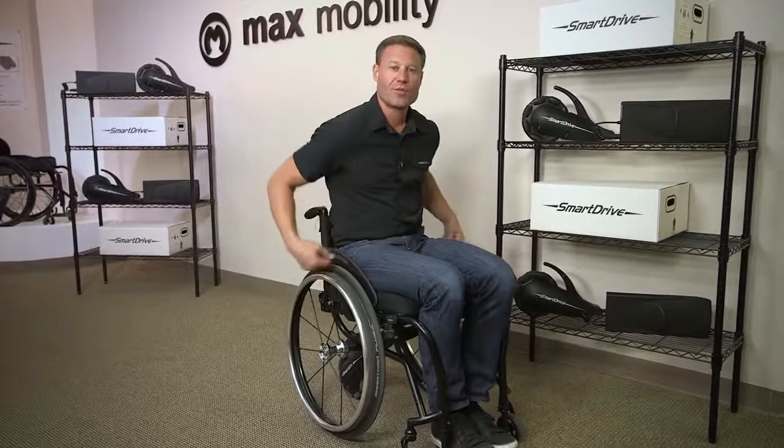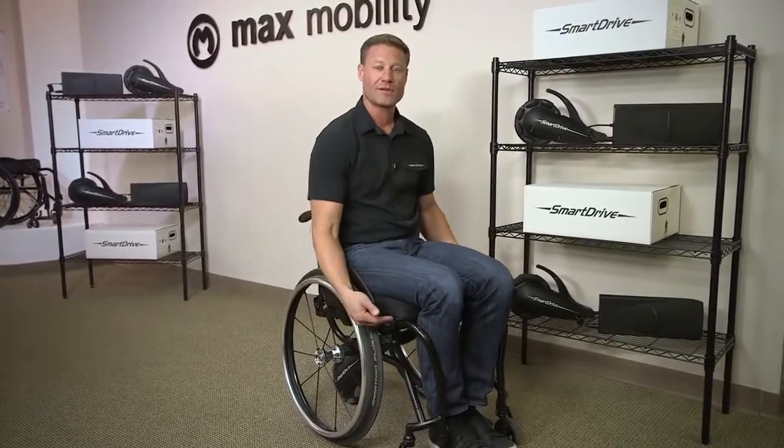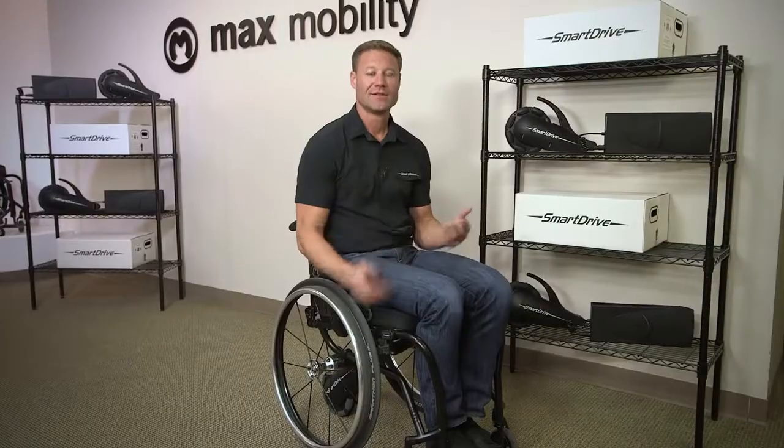So in indoor mode, you push the chair to go, and you push the button to stop. The SmartDrive works like a cruise control. If you push slow, it'll go slow. If you push fast, it'll go fast. Let's try it out.